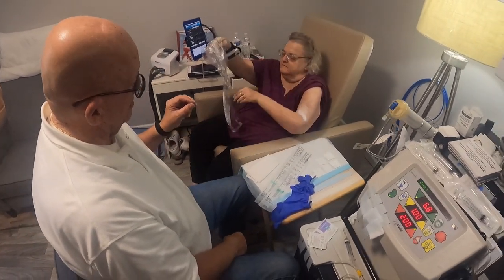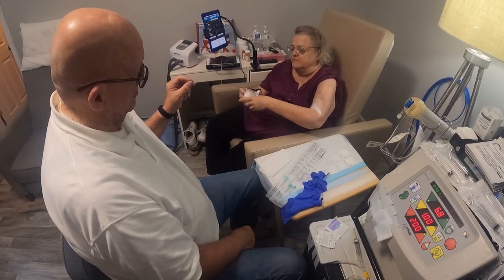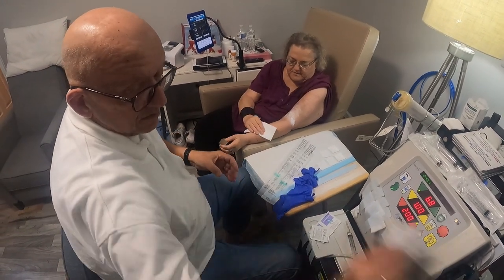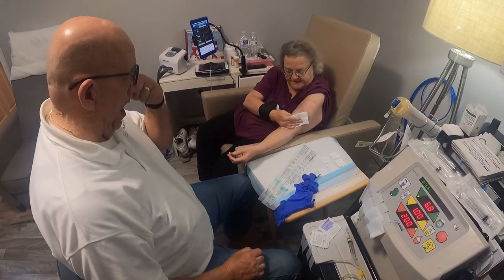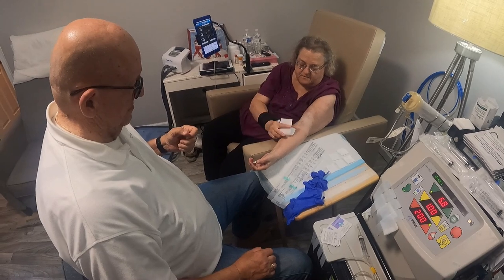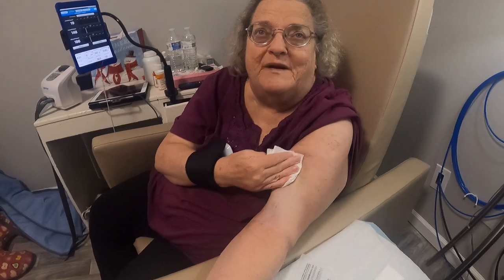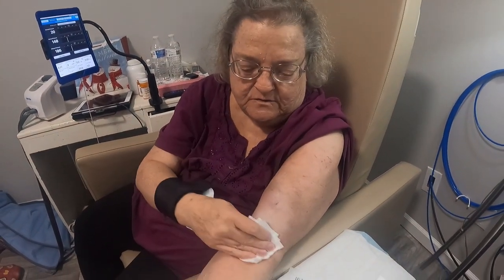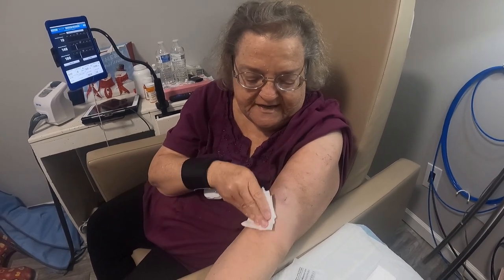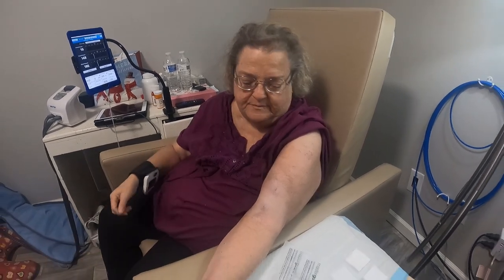There's two kinds of lidocaine. There's regular lidocaine, just straight lidocaine, 4-5%. It doesn't work quite as well. So my doctor prescribes lidocaine prilocaine, 2.5% each, and it just makes the arm completely numb. Once I take it off, it's numb for about 30 to 45 minutes. So it's plenty of time, even if we have issues with sticking the needles or anything like that. It's plenty of time to still get them in without causing pain.